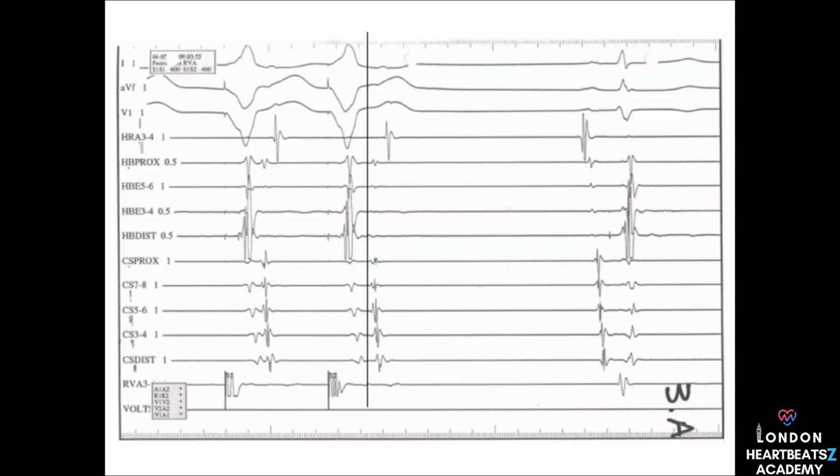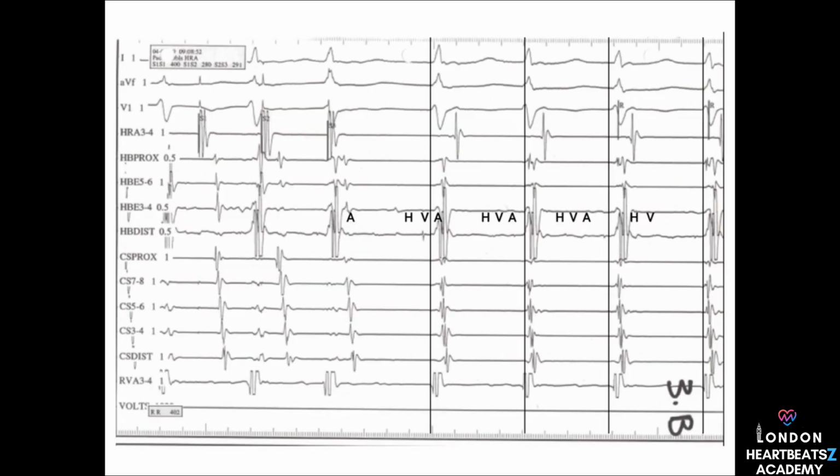Interesting. Okay, figures 3A and 3B are showing us induction of AV-nRT again, but this time using both ventricular and atrial extrastimulus pacing. So we're trying different ways to trigger AV-nRT. What's the result? Well, in figure 3A, with ventricular extrastimulus pacing, we see that decremental VA conduction again, which points to retrograde conduction through the AV node. And we also see concentric activation. That means the atrial activation is spreading outwards from a central point. Okay, so ventricular pacing shows us the retrograde conduction and how the activation spreads.